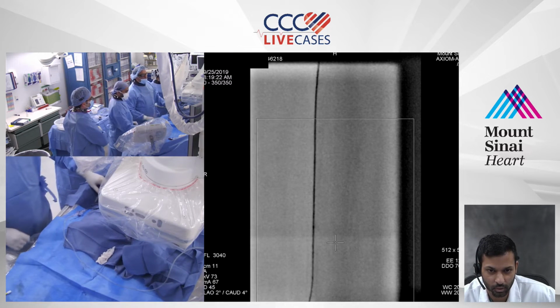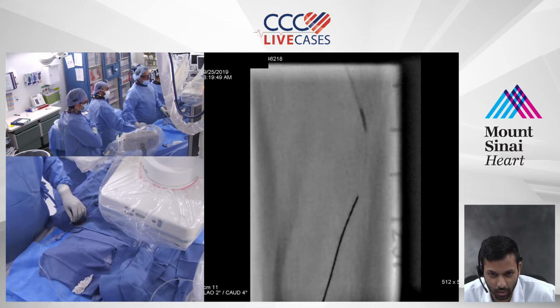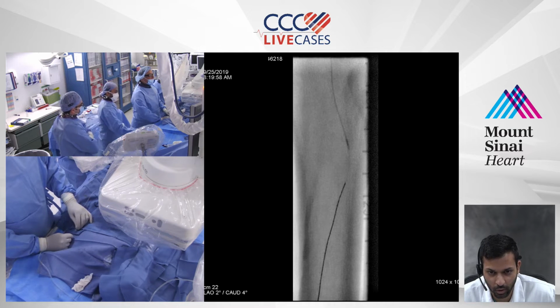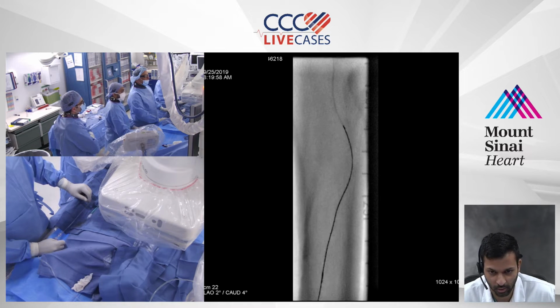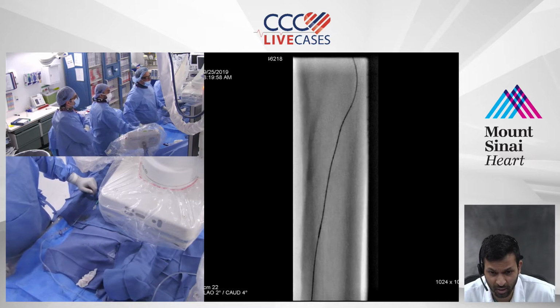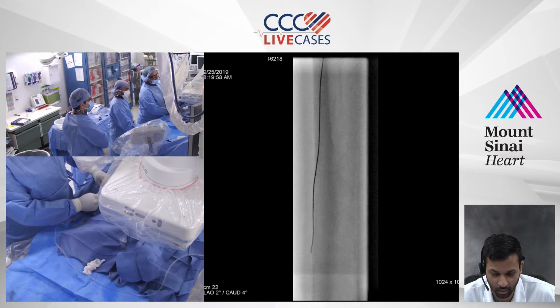And then just some other things I think about. Also, if they have an open option, if they have one tibial vessel and a bypass option, they have a good vein, then I'm going to be much more reluctant to try pedal access. If I can't cross it, then I always have that option of doing the bypass. So that's another consideration. And then the last is which tibial vessel it is. Personally, the PT and the AT and DP are really the ones I go for.